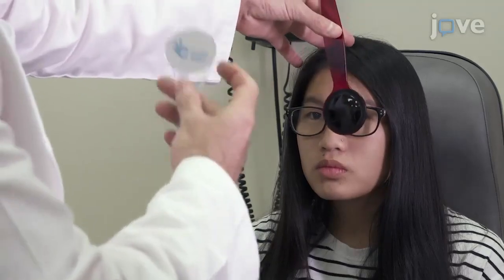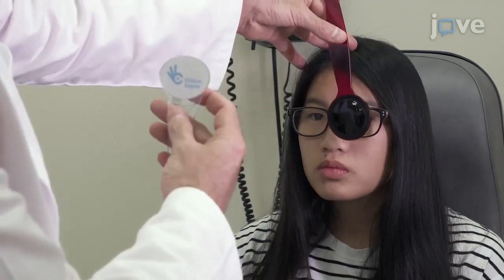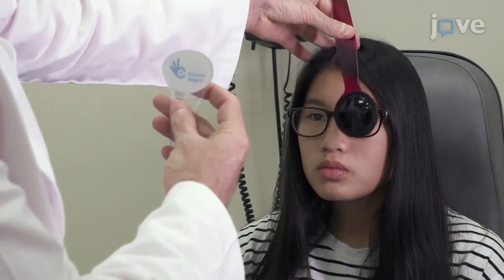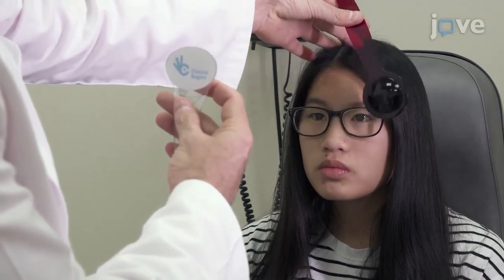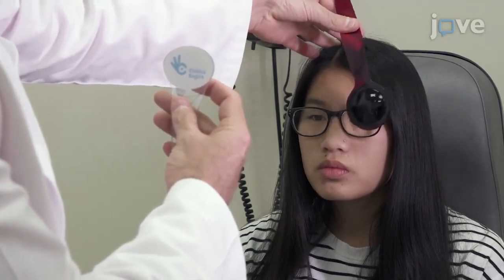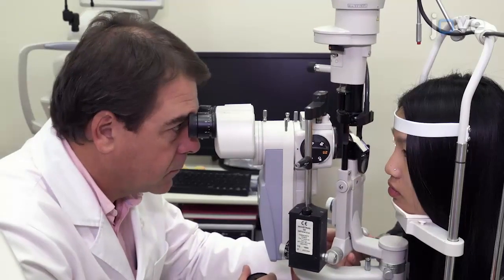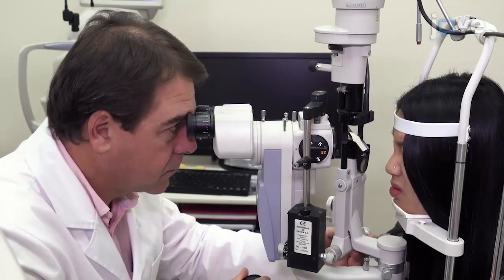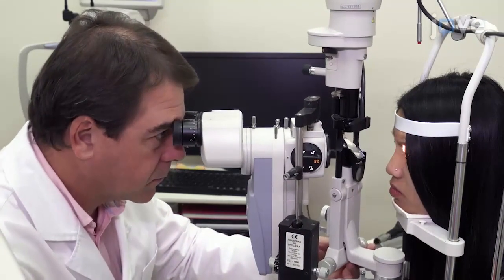This technique is designed for young patients with a history of anisometropic or strabismic amblyopia with no ocular deviation, a decimal visual acuity value of at least 0.8, and gross stereopsis. The protocol is part of the vast body of research into perceptual learning as applied to the treatment of amblyopia.